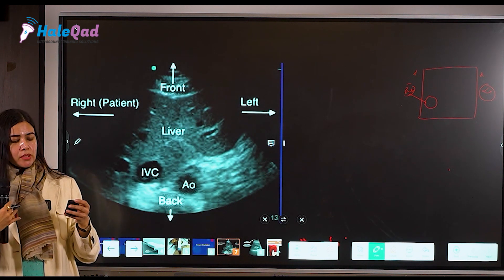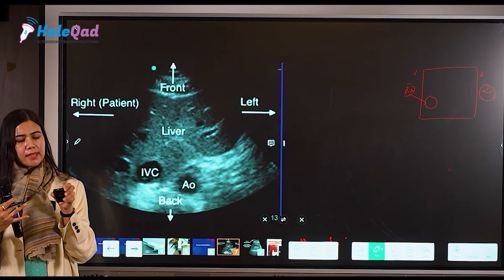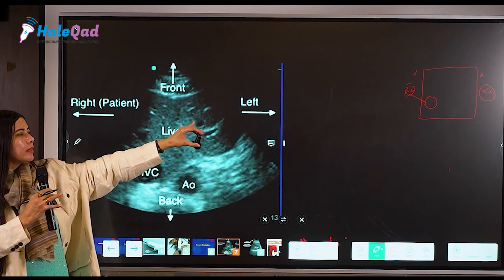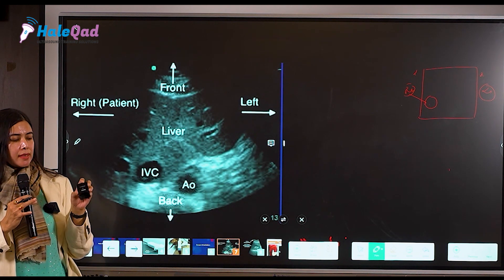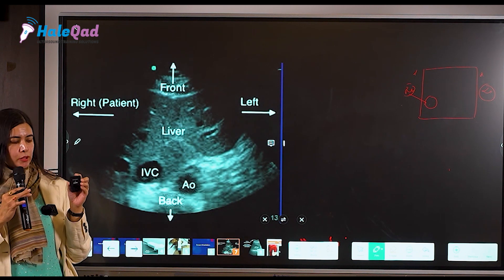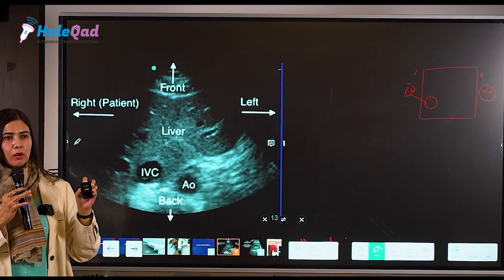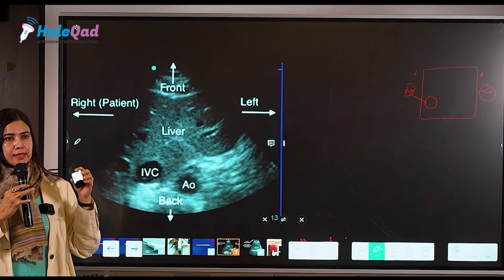Suppose this is your probe marker — if the patient is on my right side, the marker has to be on the right side. Hold it gently. Don't touch the gray zone because your fingers will get reflected on the screen if you touch that area. Avoid touching the gray zone and scan in all planes.